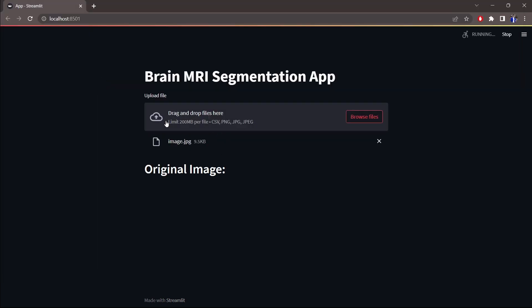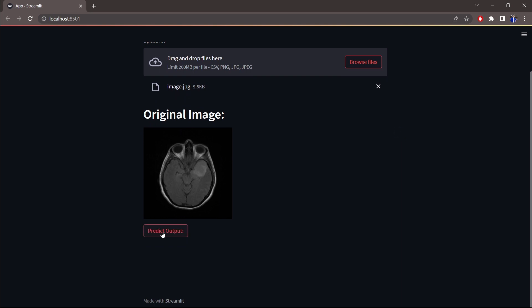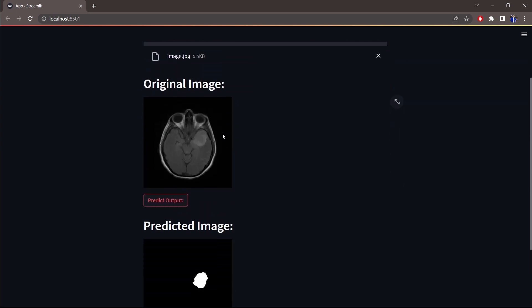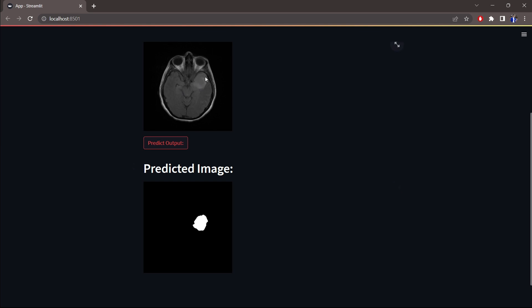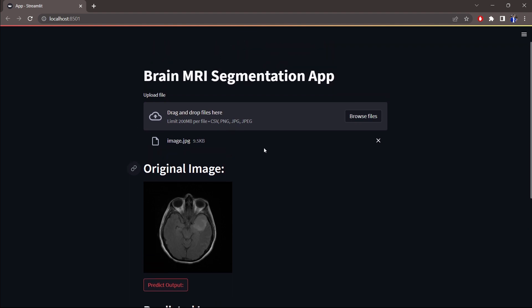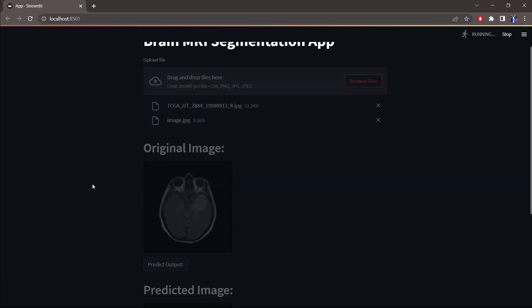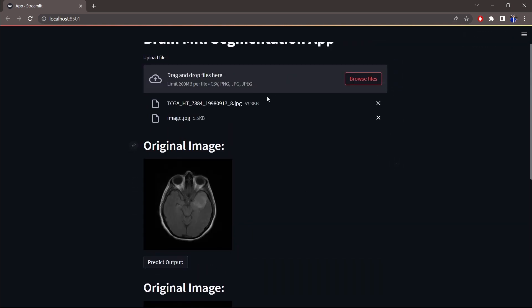Let me show you one of the example images I prepared. This is the MRI image I downloaded, and here is the 'Predict Output' button. After clicking it, the machine starts running. As you can see, this is exactly the output we are expecting from an MRI segmentation app. The model achieved an accuracy of almost 94% — to be precise, 93.96%.